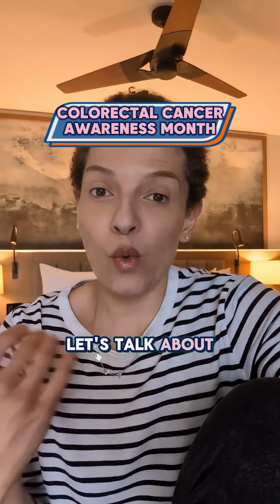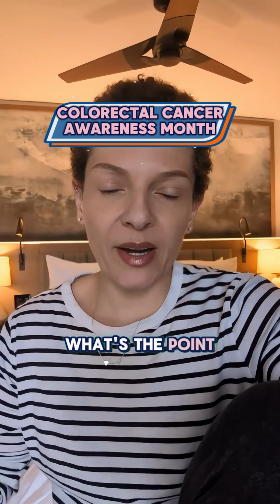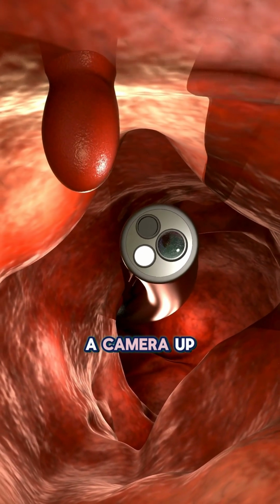Okay, now let's talk about what we look for during a colonoscopy. What is a colonoscopy? What's the point? A colonoscopy is a colon cancer screening evaluation that we do. We put a camera up your bottom.